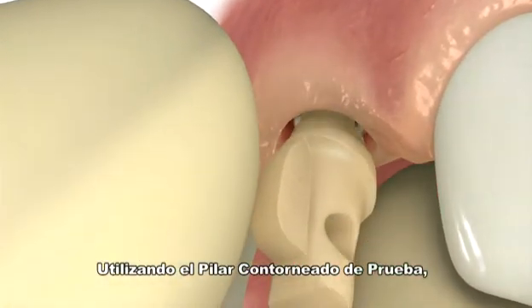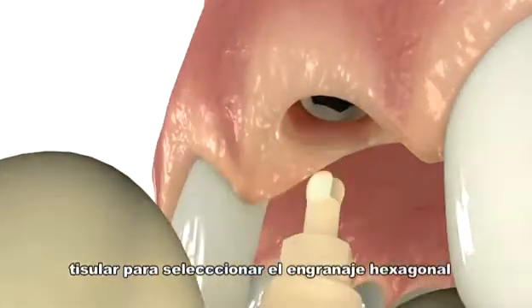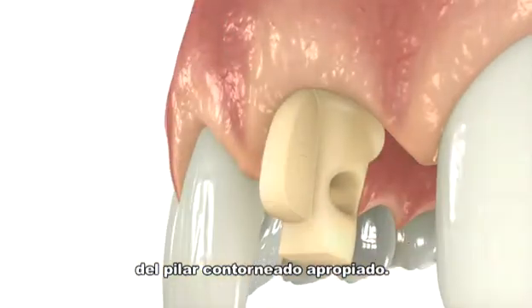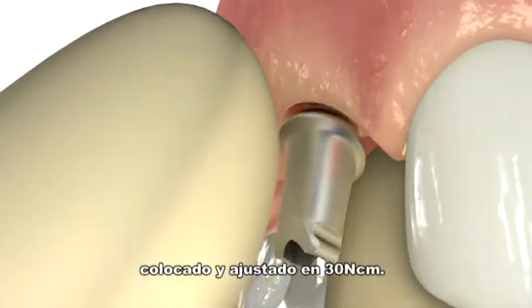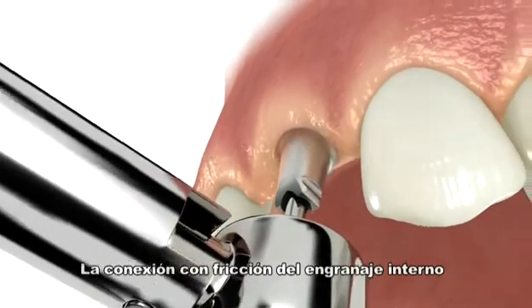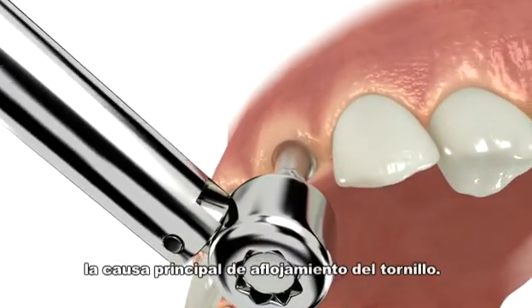Utilizing the contour abutment try-in, the dentist determines the tissue height and angulation to select the appropriate hex lock contour abutment. The selected abutment is placed and tightened to 30 newton centimeters. The friction fit internal hex connection virtually eliminates micro movement, the leading cause of screw loosening.